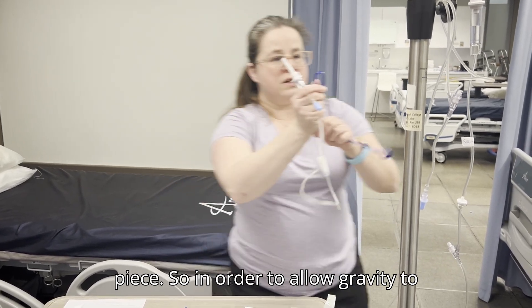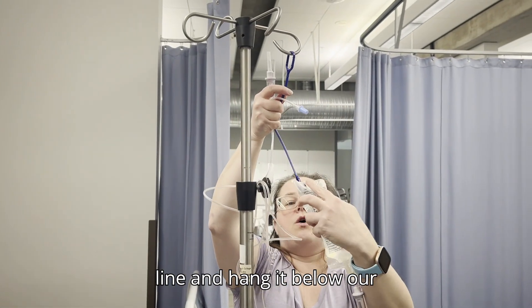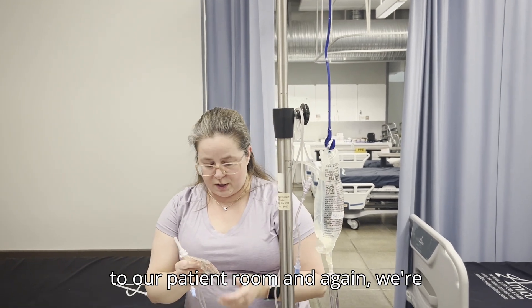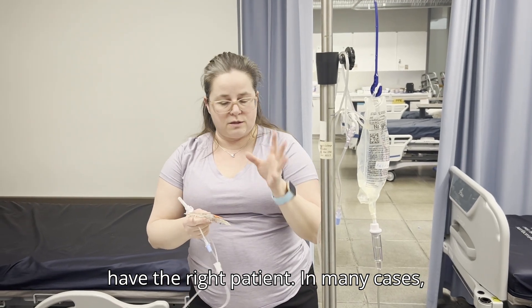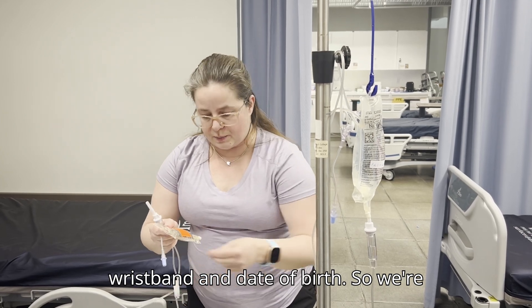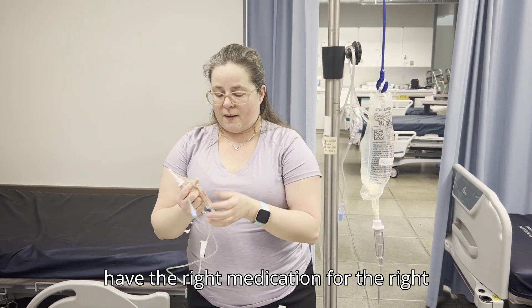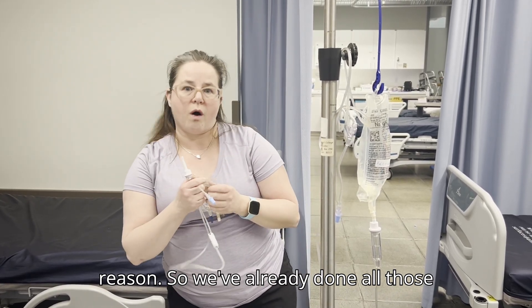The second piece of the secondary set allows gravity to work by hanging the primary line below the secondary line. We take our medication into the patient room and verify our patient — in many cases you'll scan the patient or confirm by wristband and date of birth. We make sure we're in the right patient's room with the right medication. We've already verified the right medication, right patient, right time, and right reason before bringing it in.